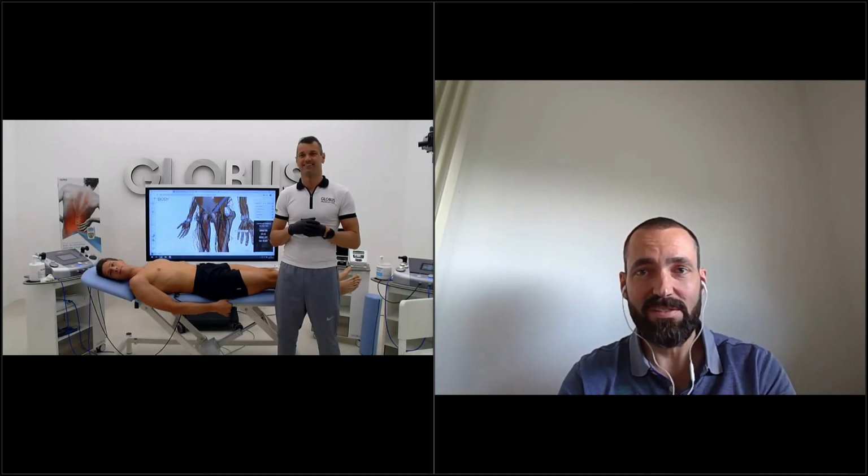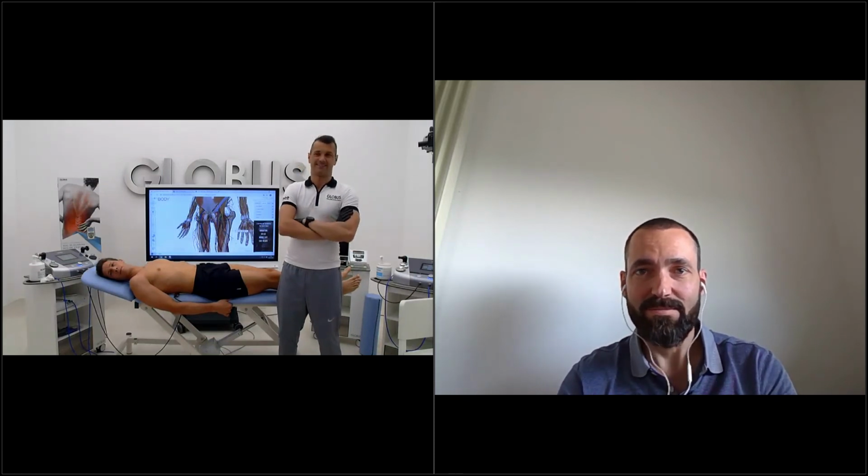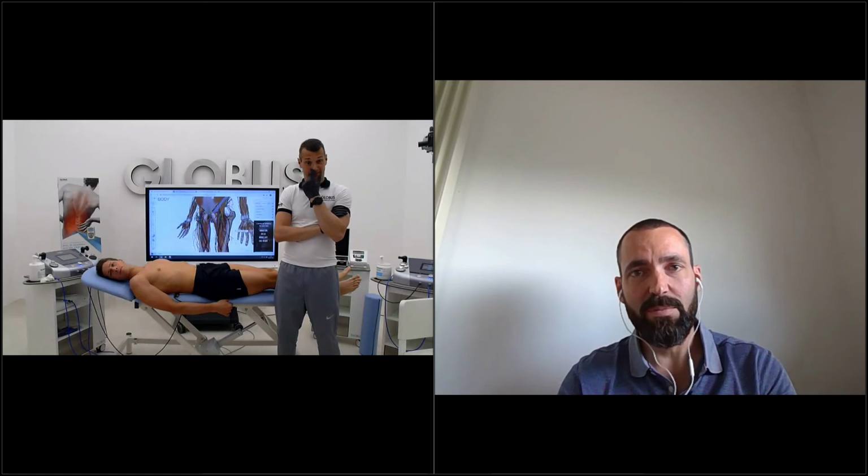Yeah, it's a big problem for athletes. Retraction, chronic, means it's already been a long time, so probably you have a big fibrosis in that position. We can combine everything, unless it's too painful, which means it's not so chronic a phase. You should give more elasticity and resistance to that new scar tissue.